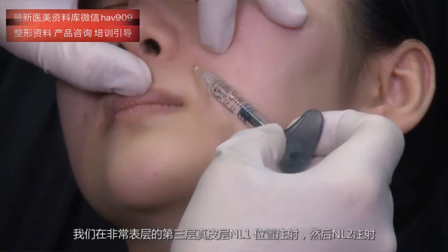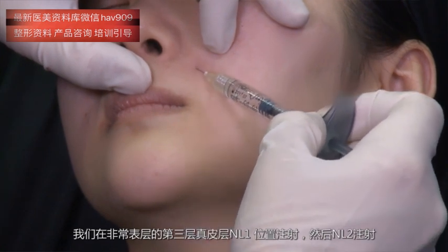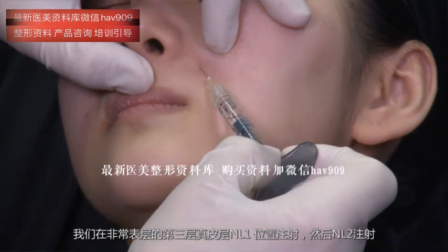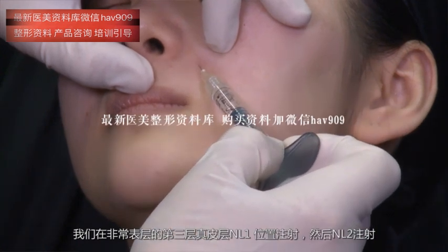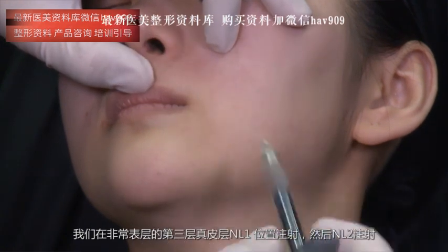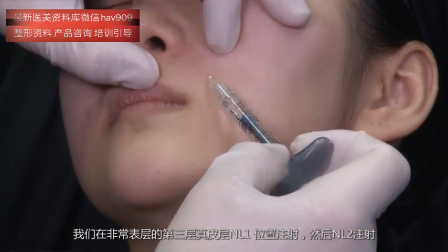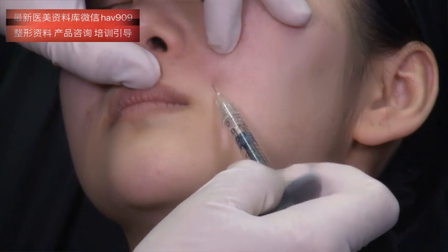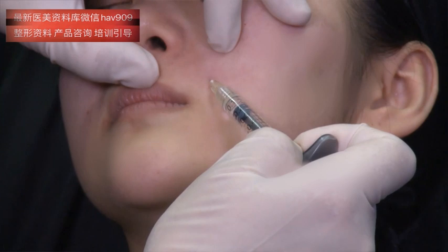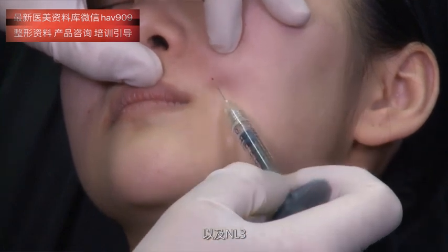We inject very superficially in the subdermal plane in NL1, going to NL2, and NL3.